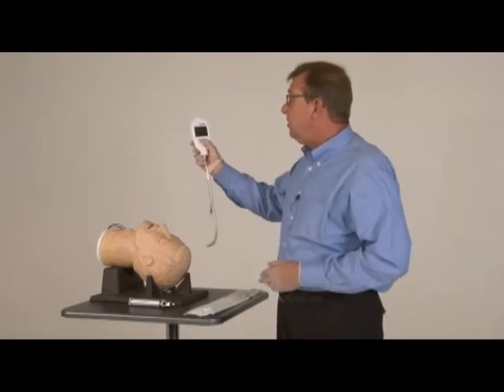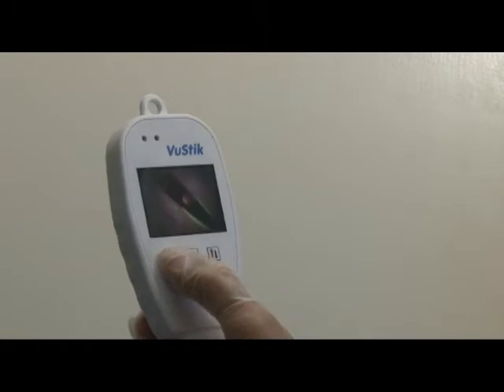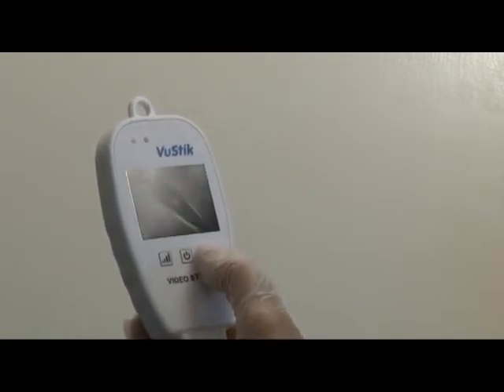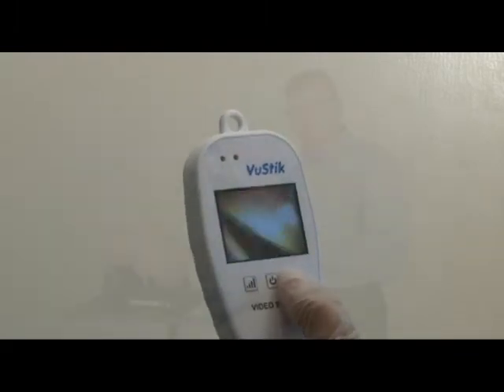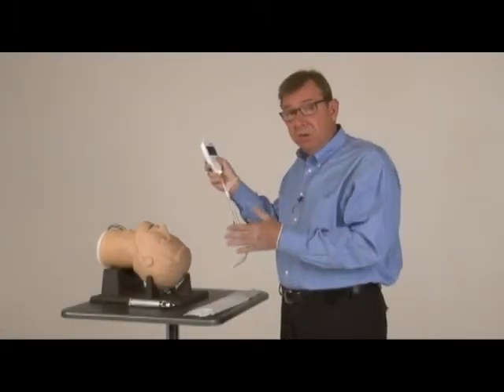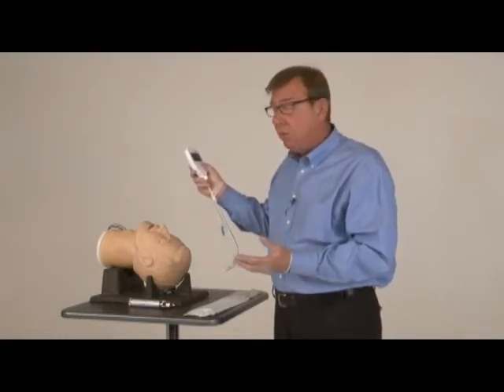You turn on the screen with this button. You increase or decrease the brightness with this button. And with this third button, you can actually flip the image, which makes it possible to intubate a patient in tight, restricted quarters where you have to approach them from their head — or trapped in a car or immobilized in a KED board.